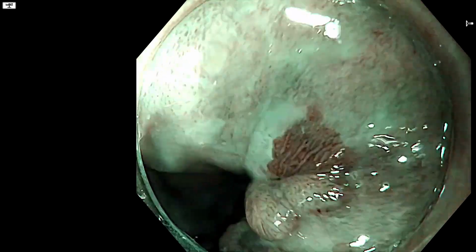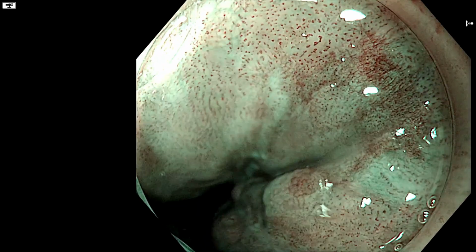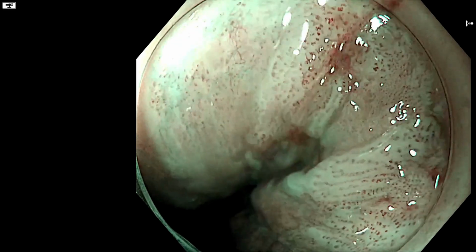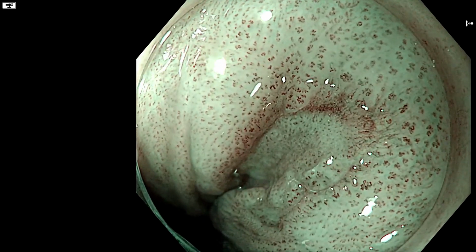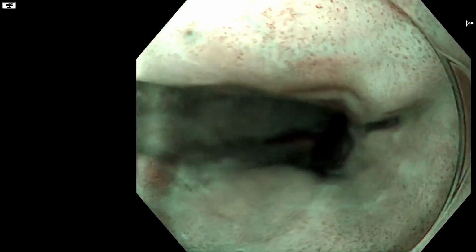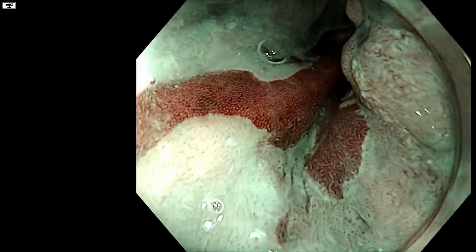So there's a whole flat area associated with this lesion. Now, if I freeze again, I'm not talking about in the 6, but I'm talking about towards the 2 o'clock area, which is definitely also abnormal. And so you must also remove that alongside this lesion. And some inflammation probably in the IPCLs around the lesion, but the lesion probably ends here. And that's the highlights of this video. That's something interesting that you may otherwise not see.